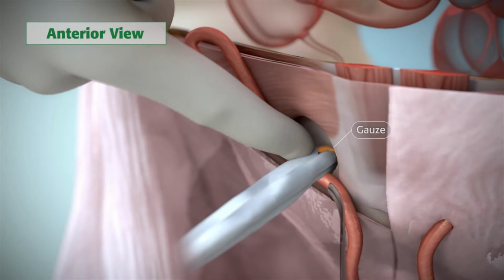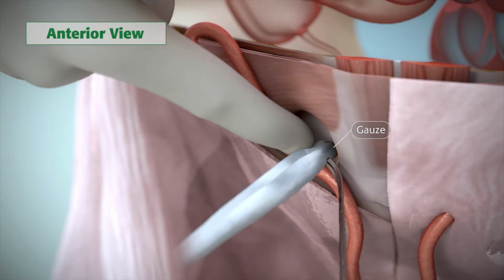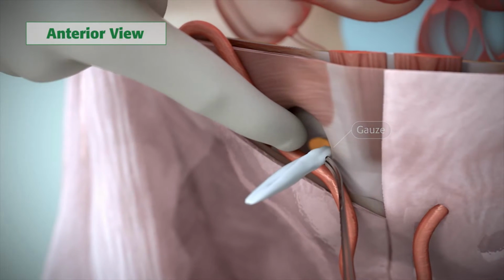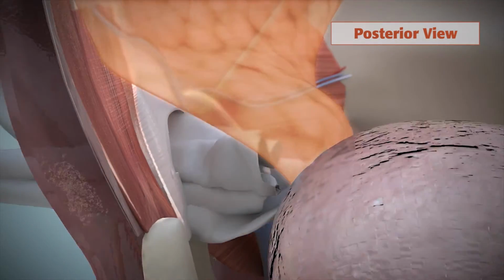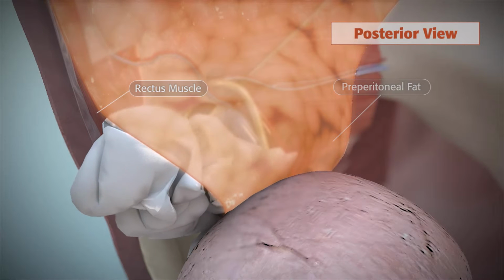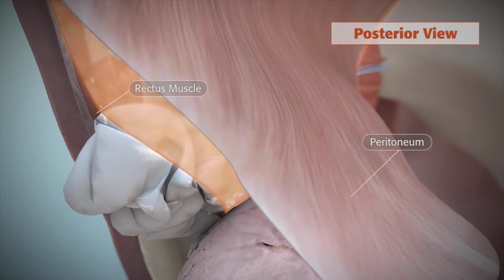Using blunt forceps, guide a large 20 by 20 cm moist sterile gauze down the index finger into the space of Retzius. No digital dissection of the preperitoneal space or space of Retzius is performed during the ONStep technique.